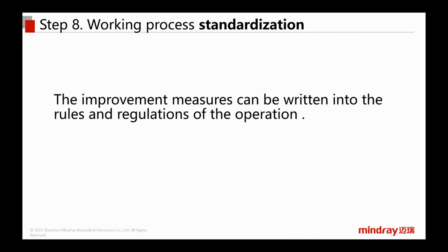As I stated before, the risk is always increasing, not only with technology and devices introduced into a hospital, but also from new staff you recently recruit, new business models introduced in the hospital, and other new factors involved in the working environment. So this is always a dynamic process, and that's why, as I stated before, we recommend doing this kind of analysis at least once per year.